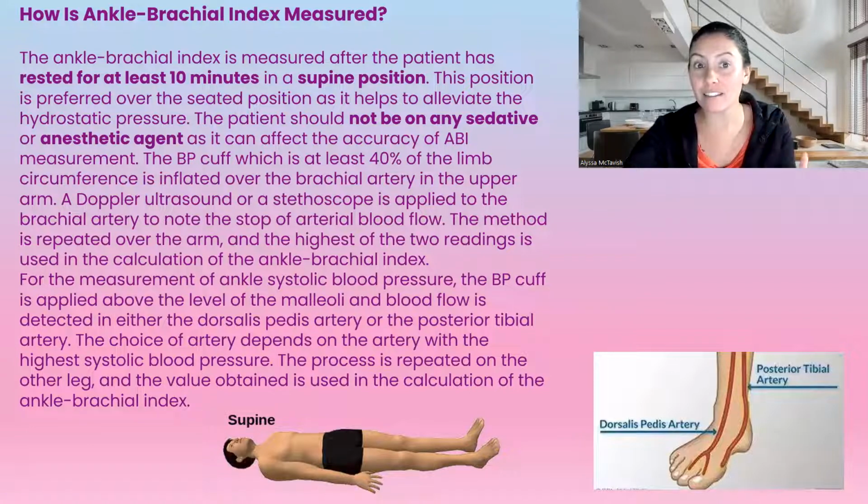So this does take some time to perform, okay? So we do the dorsal, which is on the top of the foot, and the posterior tibial artery, okay, on the inner ankle bone here, okay? So we do the same thing, make sure.